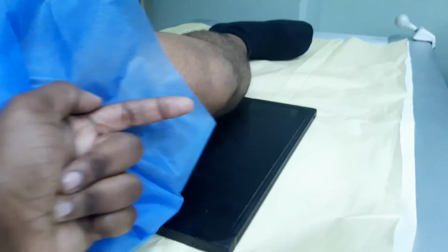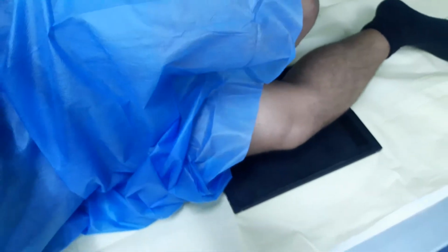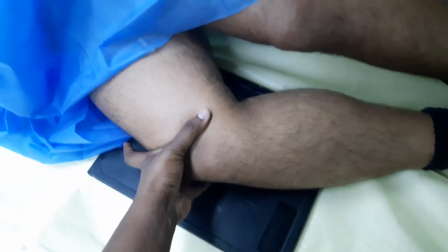So if you watch his knee right now, this was him putting himself into this position naturally. If you watch the position of his leg right now, you would see that his knee is actually pointing at an angle going up, kinda, right? So what I'm gonna ask you to do is turn all the way onto your side. Make sure that the hips roll forward as well and adjust yourself, make sure that you're comfortable, right? So as you see naturally, his leg is now rotated in more of a true lateral. From there, you don't want superimposition of the other leg, so you have them straighten out the leg to the back, right? Keeping the ankle kind of close by, straightening the knee. Good. So that's what I do.